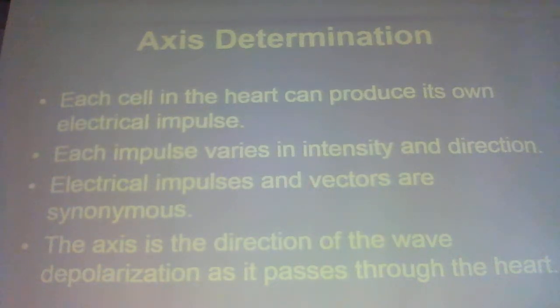There are other blocks that are called fascicles. If you look on that piece of paper, it shows you, on the left side, you have a posterior fascicle and an anterior fascicle. And that correlates with this sheet, the very right side of this sheet, talks about fascicular blocks.